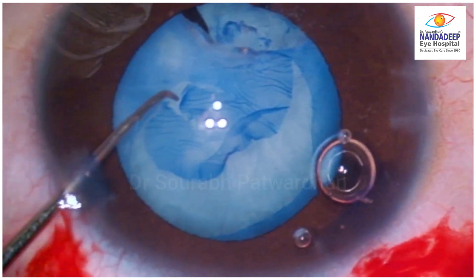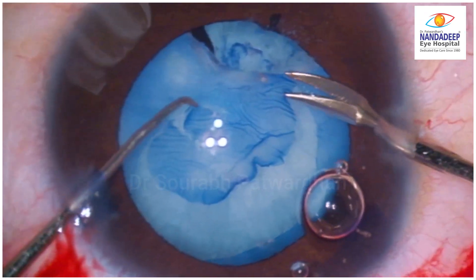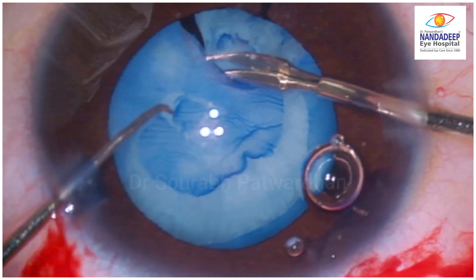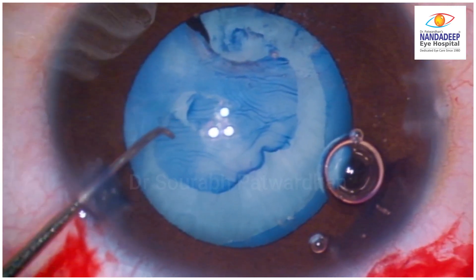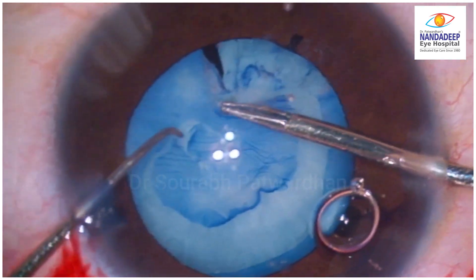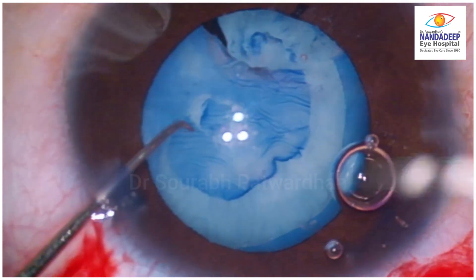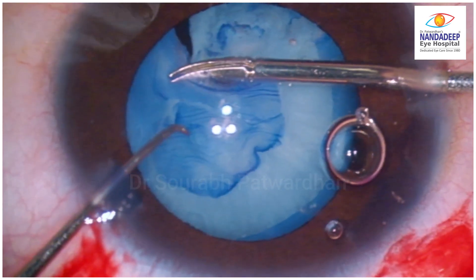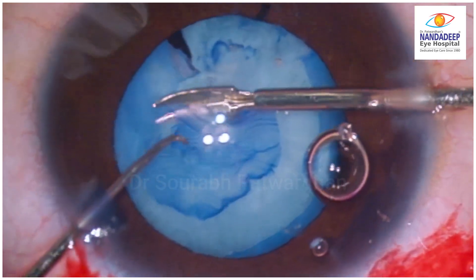As I come to the end you can see there is intense fibrosis, so now I am going to use the caesar — these microrhexis scissors are essential for dealing with these cases. I cut it on the other side also. After making the cut I am trying to complete it using the forceps again, but there is still subcapsular fibrosis and I don't want to pull it more because I don't want that tear to extend to the zonular area, so I will use the capsule rhexis micro scissor to complete the rhexis.